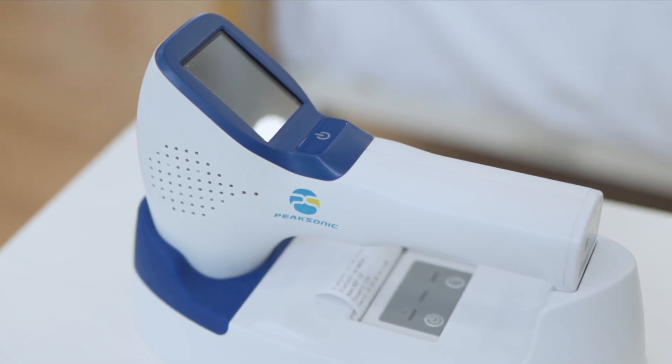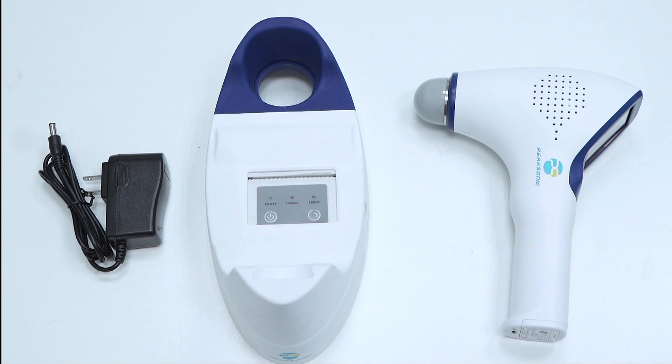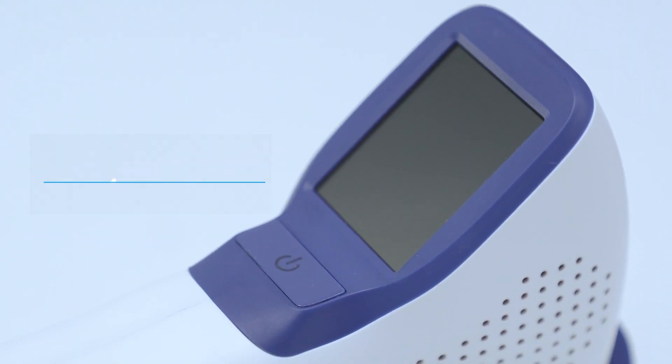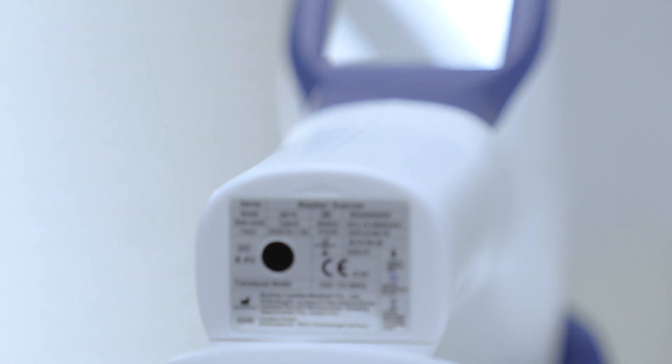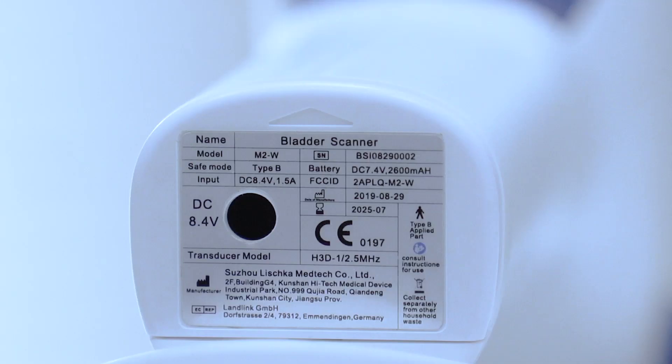Peak Sonic Bladder Scanner is a handheld structure consisting of a probe and docking station. It has a 2.4 inch touch screen. Below the touch screen is the power and scan button. The charging socket and USB port are at the back of the device. The battery can be inserted or removed from the back.